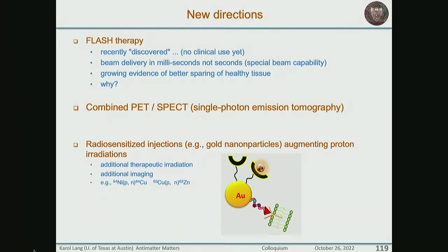I actually believe that if we can truly show that we are accomplishing about 1.5, 1.6 millimeters, which there are indications our device is doing, we're done. I don't want to be going anywhere else. But yes, you can find papers where people are arguing for 0.7 millimeter by 0.7 by 0.7, ours being 3 millimeters by 3. People argue 0.7 millimeter crystals. Well, there's a longer story to it. So yes, there are arguments, but the more I know about it, the weaker they seem to me.